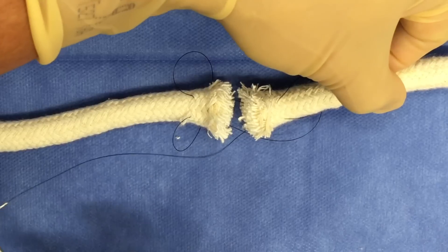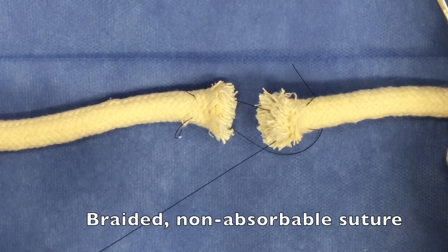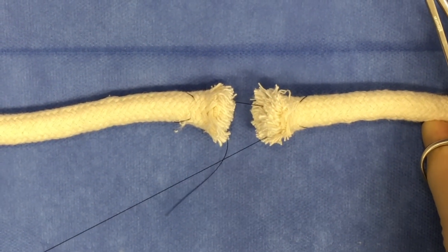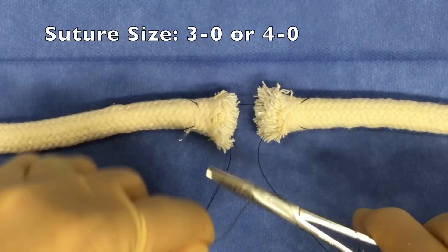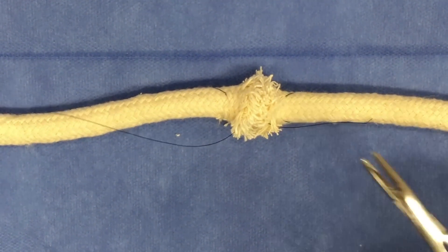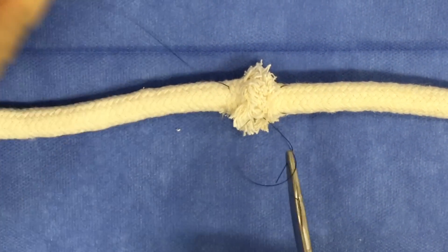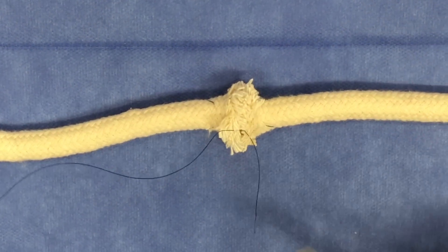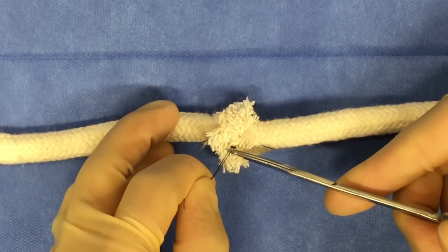When performing this technique, you're going to want to use a suture of sufficient strength. Typically a braided, non-absorbable suture such as Ethibond is ideal for this type of repair. Please note: in this demo video only, I'm using a 3-0 nylon suture, and that's just because it provides good contrast against the background. A 3-0 or 4-0 size suture is appropriate depending on the tendon size. Make sure you tie off your square knot within the cut ends of the tendon itself so there are no exposed knots. Those exposed knots, if sitting on the dorsal or ventral surface of the tendon, can lead to friction, adhesions, and problems as that tendon heals, which can be noticed by the patient as a little bump or even affect the glide of that tendon over time. You'll cut close to the knot for this same purpose.